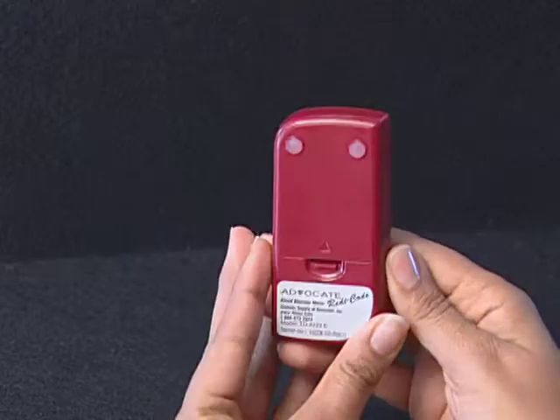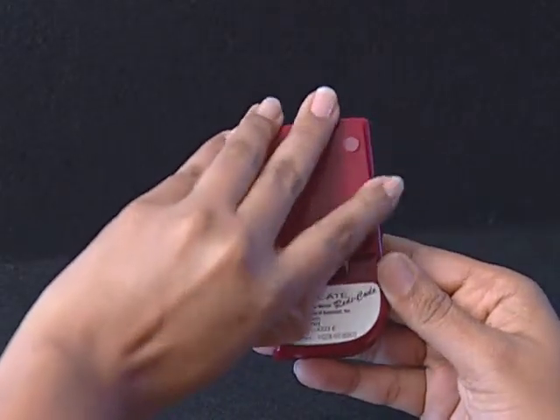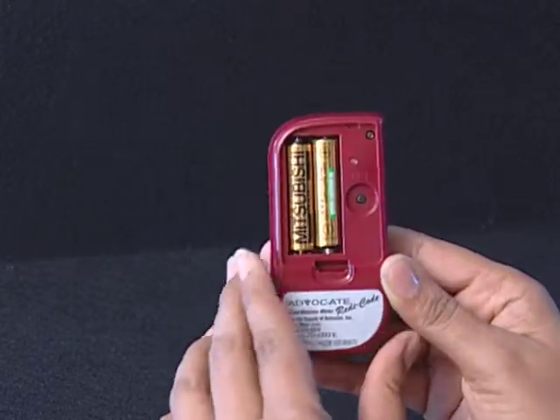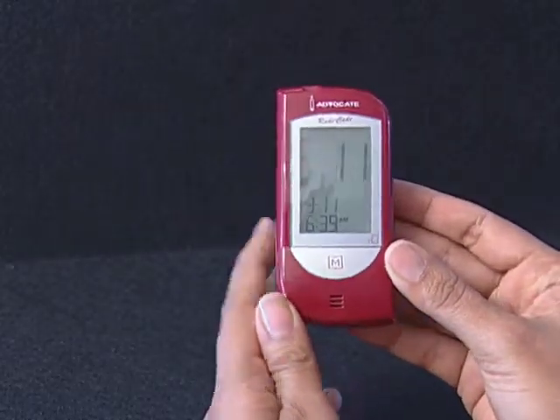Start with the meter off, then press the Set button located in the battery compartment. The meter is now in the setting mode. You can start setting up the meter.